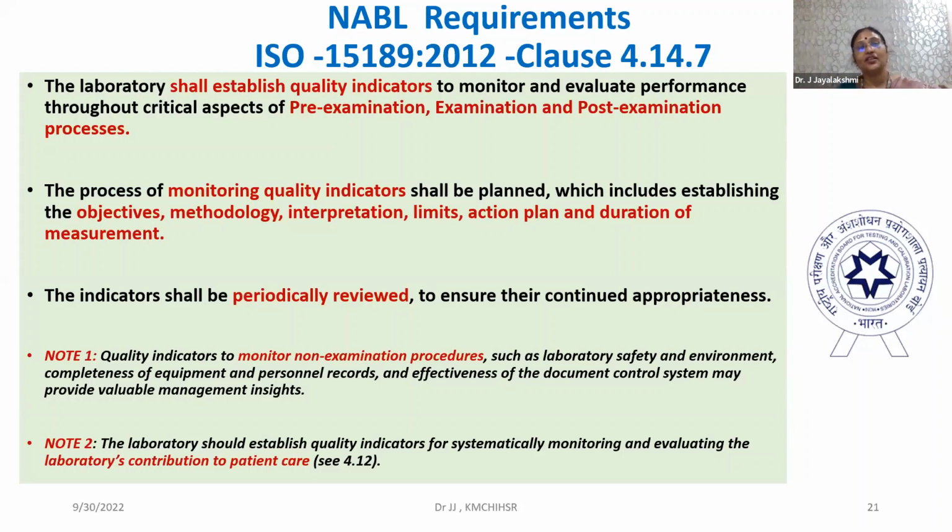It'll also mention that you will have to follow up these patients, follow up and define turnaround time after discussing with the concerned clinical team. You cannot say one whole day for a gram stain, or 1 week for my culture reports to come, because I don't know the organism when it will grow.